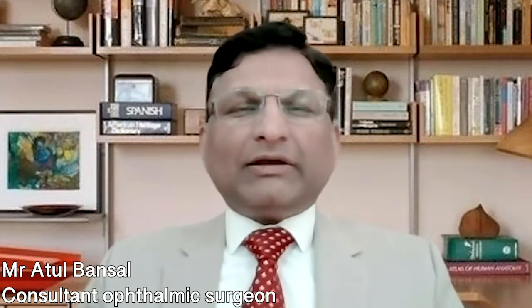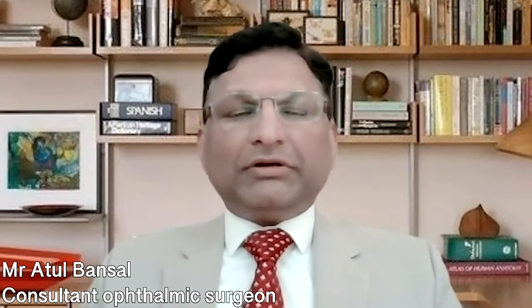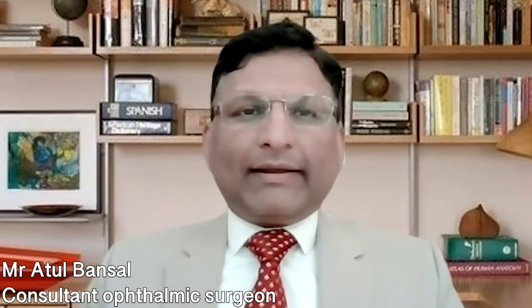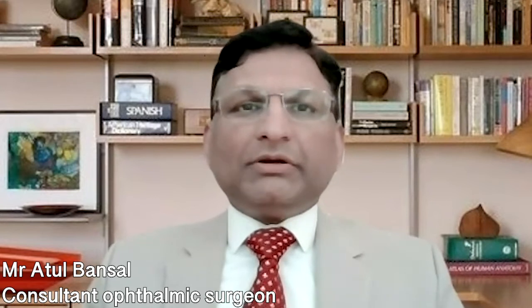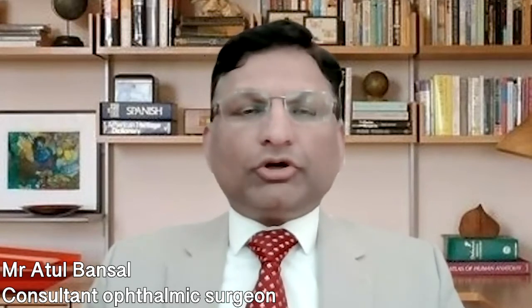Selective laser trabeculoplasty is approved by NICE and recommended to be the initial treatment for newly diagnosed patients with primary open-angle glaucoma and ocular hypertension, even before they need to start the drops.